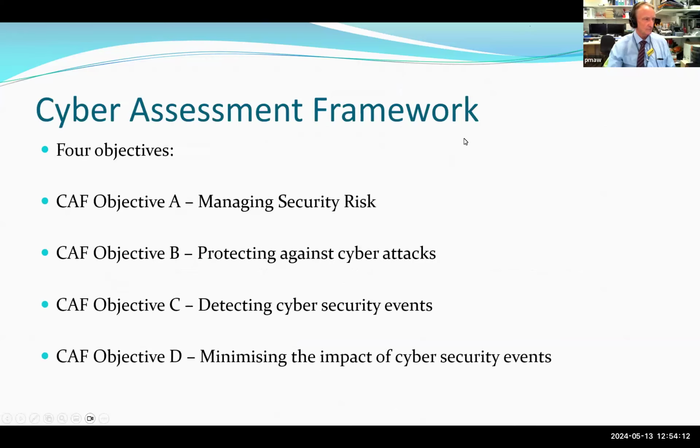I'm just going to talk very briefly about the cyber assessment framework before I finish. The cyber assessment framework is going to eventually, I'm told, replace the DSPT returns that each trust has to give every year. At the top level, you've got four objectives: managing security risk, protecting against cyber attacks, detecting cybersecurity events, and then minimizing the impact of cybersecurity events.